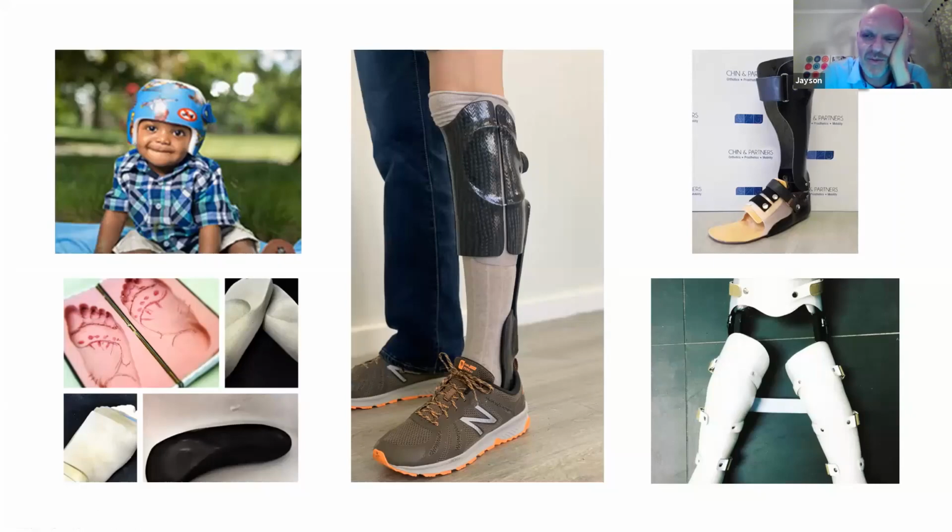So I think we just wanted to briefly touch on orthotics, and then we're going to move over to prosthetics. When asked to discuss prosthetics with orthopedic surgeons, we've had a talk before, and it's really, as a prosthetist, the urging is for the orthopedic surgeon to provide us with the best possible stump.